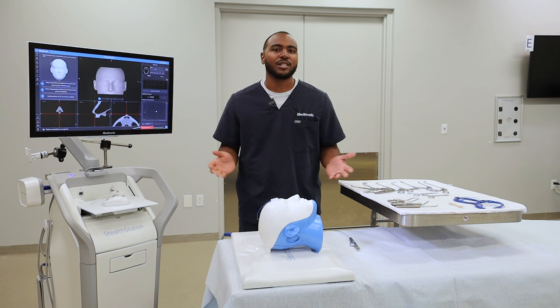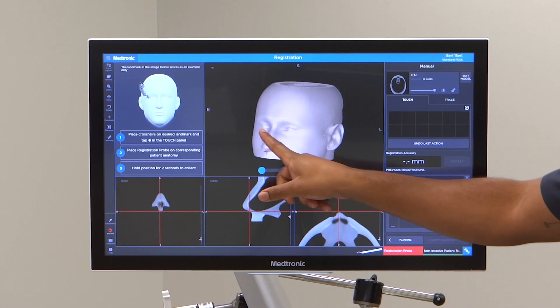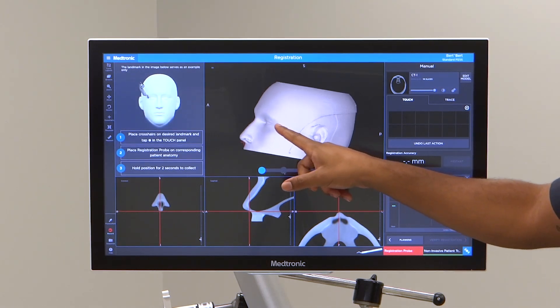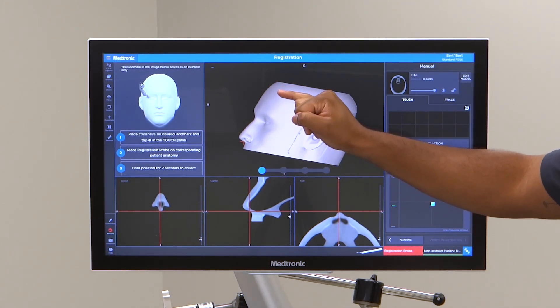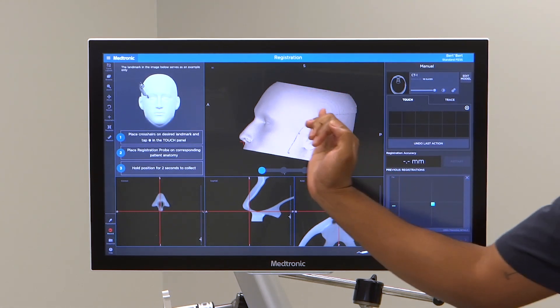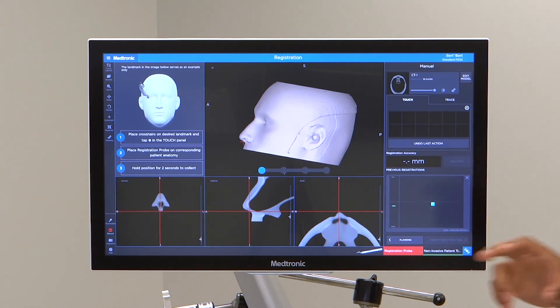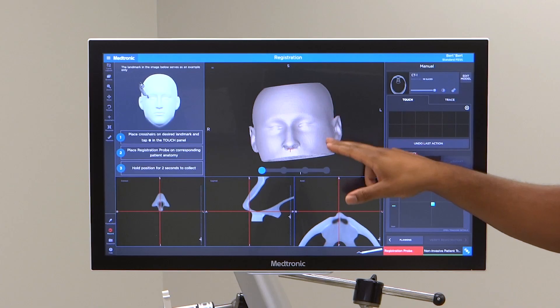I'll now demonstrate how touch registration works. If for some reason your scan is a limited field of view scan, where the top of the head is cut off — maybe to the eyebrow or just to the top of the frontal — and just a really limited field of view scan, touch registration may be the registration method for you.